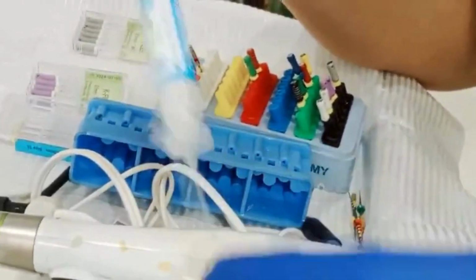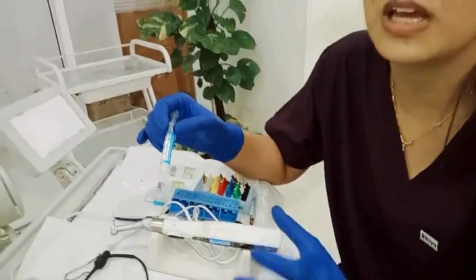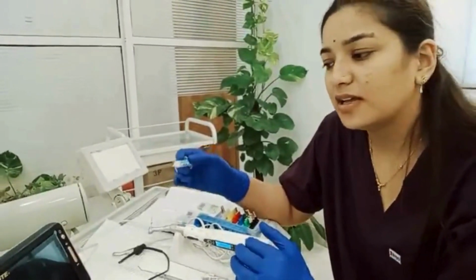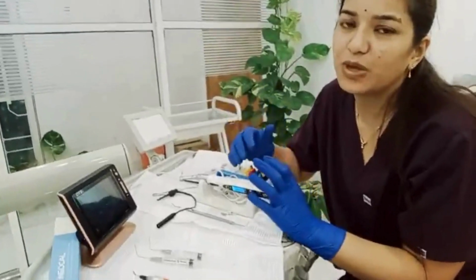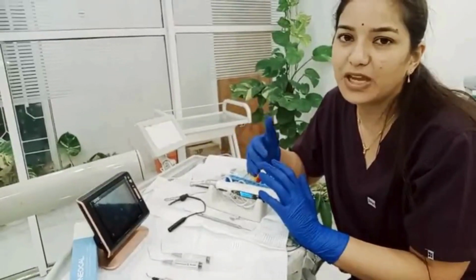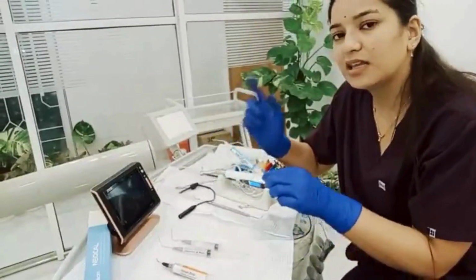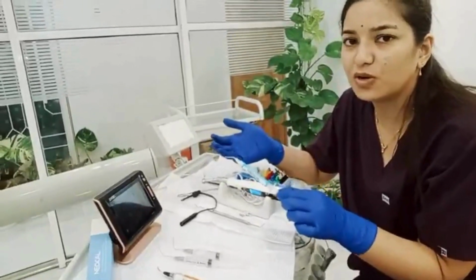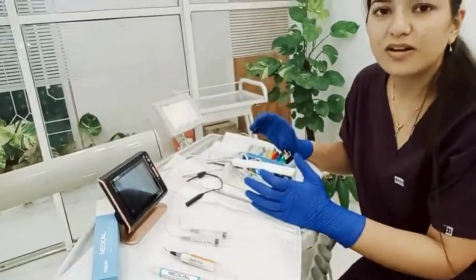So what it will do, we'll leave it for 1 week or 2 weeks, and then we'll check whether the patient is pain free or not. If the patient is pain free, we can go with the obturation, and if the pain still persists, we can again clean up the canal and again place calcium hydroxide inside the canal and then leave it for 1 week also. So this was all about the root canal treatment.